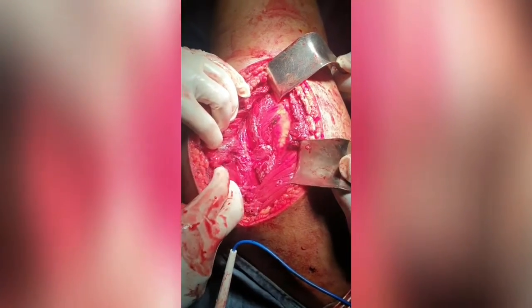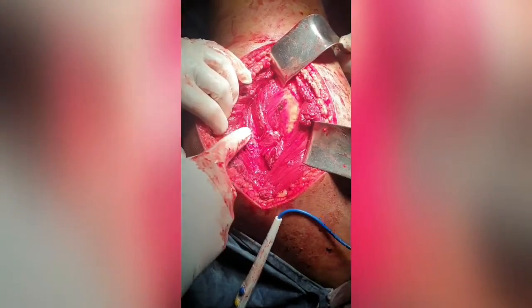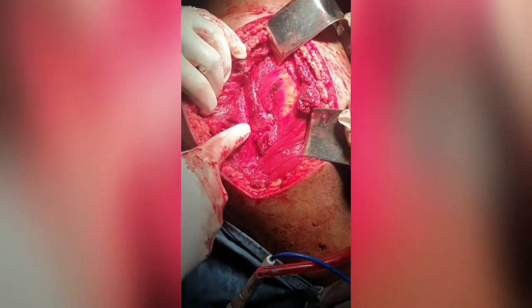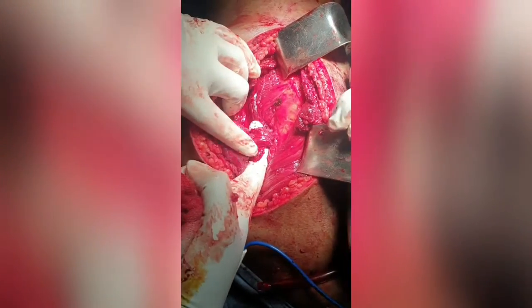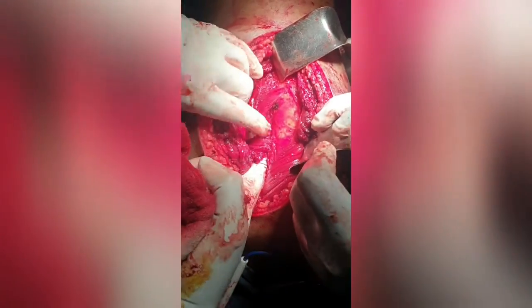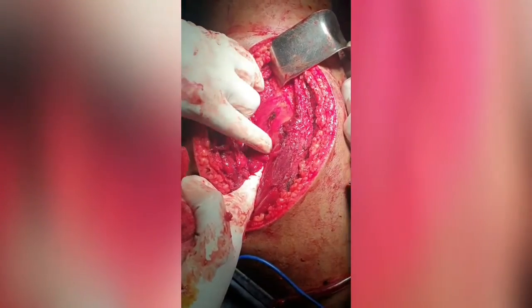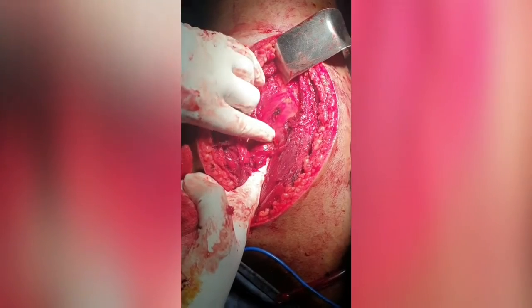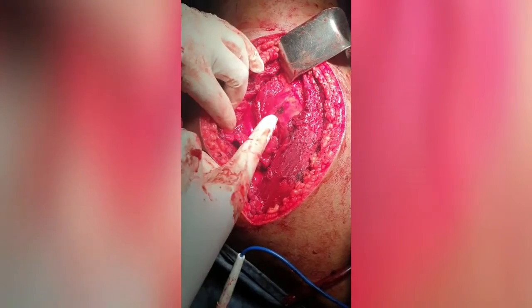At the depth of the wound, just below the gluteus maximus, there is the sciatic nerve. You can appreciate this is the sciatic nerve, and these are the short rotators. This is the conjoint tendon formed by the superior gemellus, obturator internus, and the inferior gemellus. So we'll put a stay suture in this conjoint tendon and cut it, keeping 1 centimeter from the tip of the trochanter. And this is the quadratus femoris. So we can also cut this tendon.